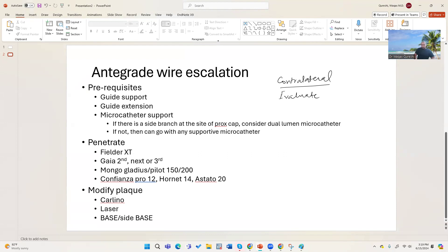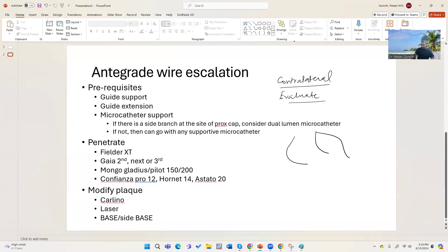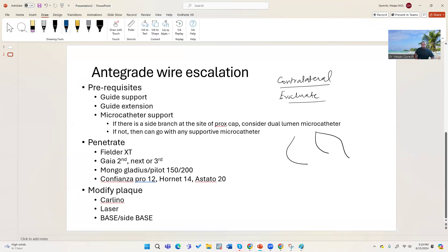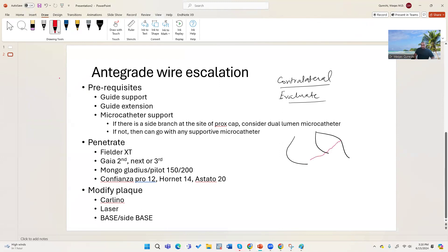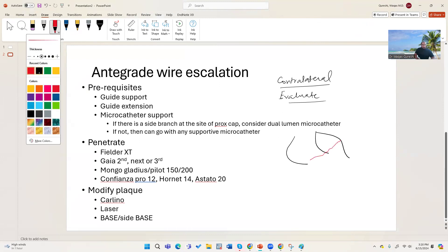It's very important to evaluate the angiogram — I'll probably make another video on how to evaluate a CTO prior to intervening. You want to take magnified shots where the whole heart is visible, where both the right and left systems are getting filled. Take five to ten minutes to evaluate that. Some people like to draw the images — right coronary artery, left coronary artery, circumflex — and map out where the collaterals are coming from, their direction, whether they are high or low frequency.